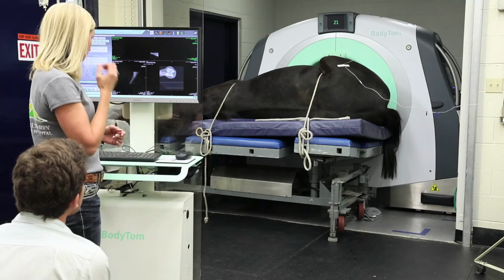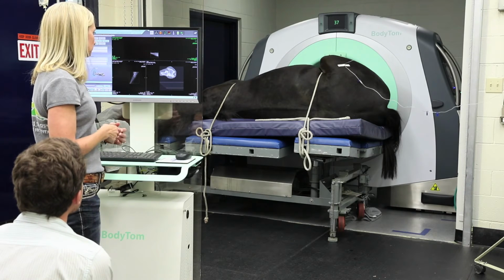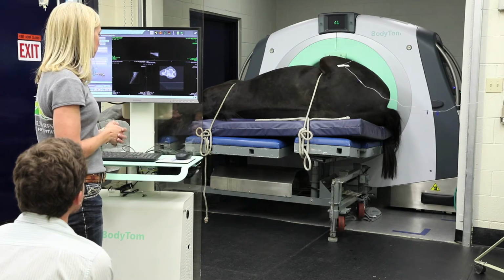For the orthopedics, fractures, we're able to see all of the issues immediately before going into surgery. So during preparation, we're able to view where the issue is, if it was more or less than we thought on the x-rays, and it gives us a high degree of confidence going in for fracture repair.